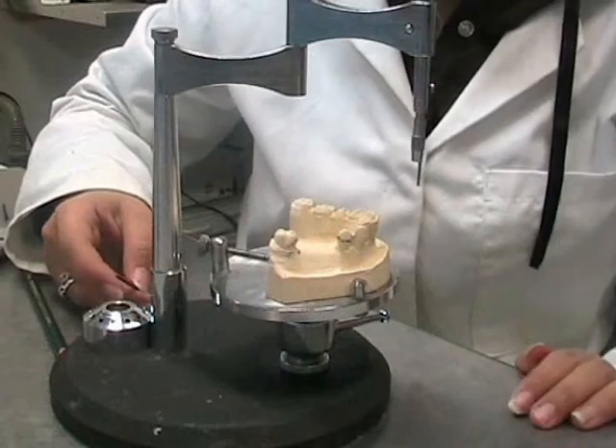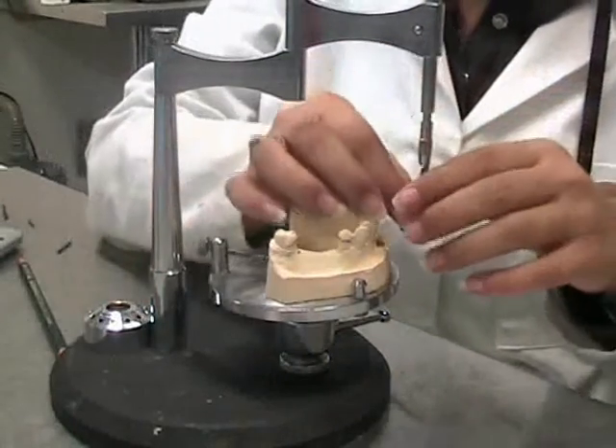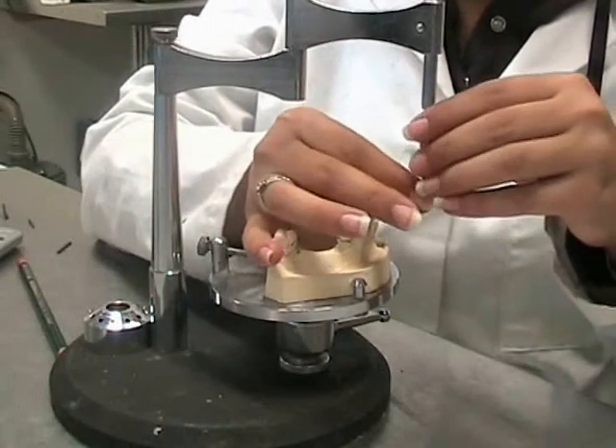The next tool that we will be using is the undercut gauge. This is placed into the chuck.